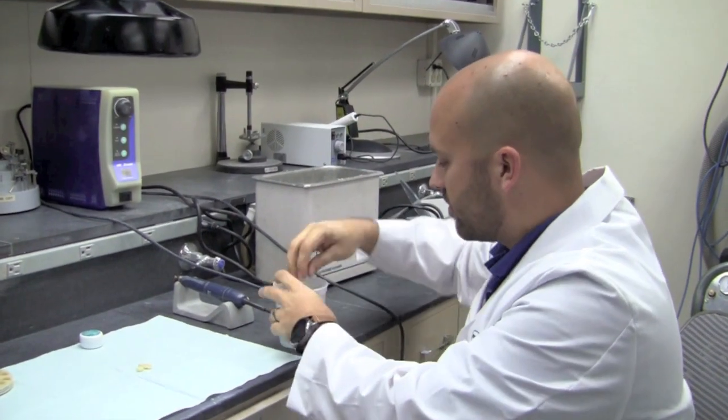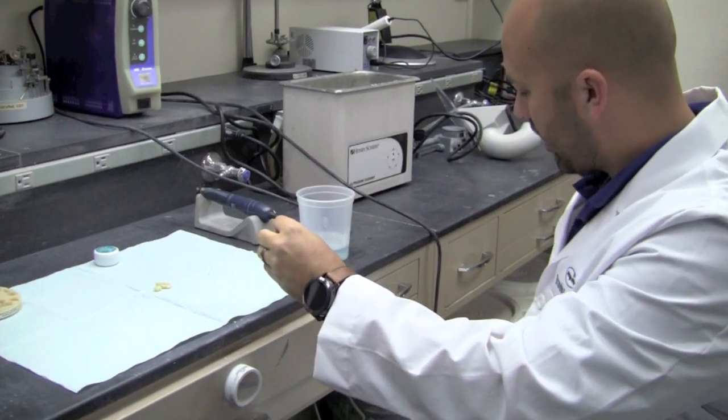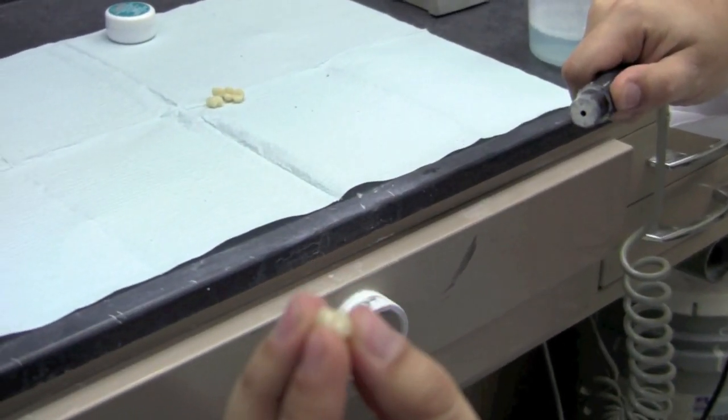So now our crown is done in the ultrasonic. I'll fish this out and we'll go ahead and dry it off. And now you get a nice polished PMMA crown.